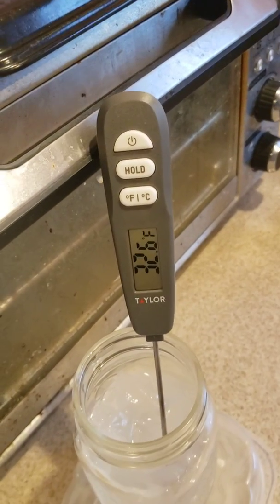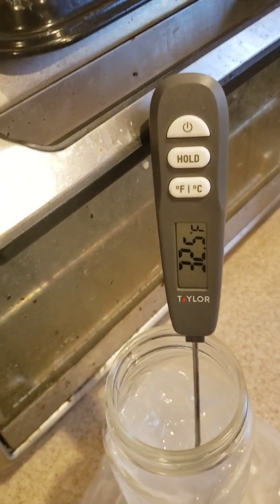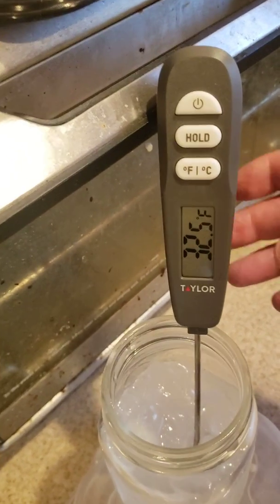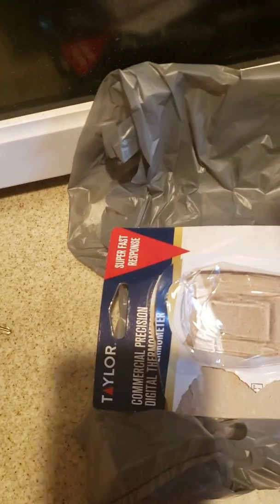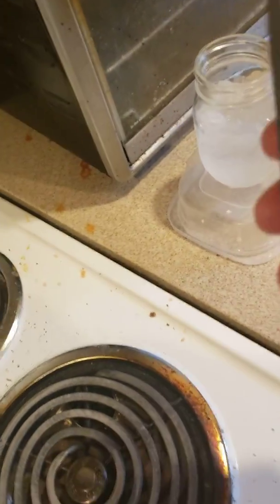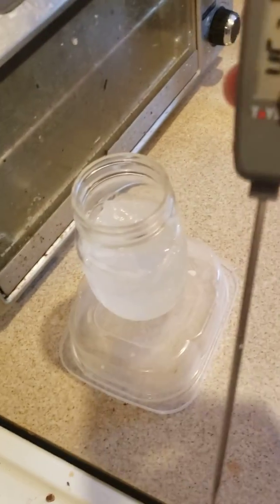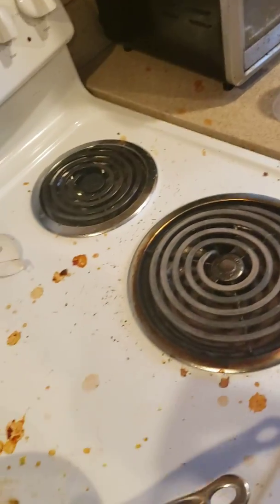It'll go down to 32.1 if I try hard. So we're within about half a degree here. To tell you what I have — I have a Taylor commercial precision digital thermometer. I went up to Walmart today and they had absolutely no body thermometers, but they had plenty of meat thermometers. So we checked the freezing temperature of water, and it's within range — water freezes at 32 degrees.